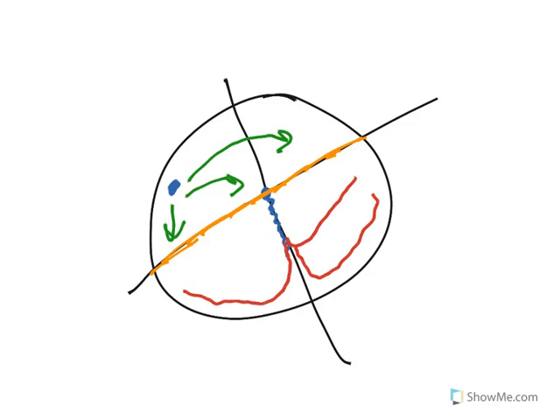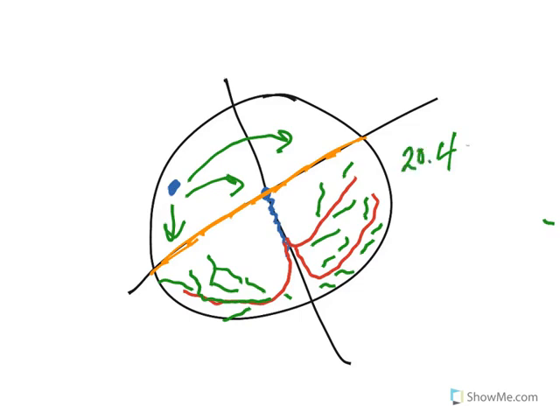Most people will tell you, again, the vast majority of your QRS complexes, sure, they will be wide, because they generally come from the Purkinje fibers themselves out here, and then they fire up and fire out and away. Well, that takes longer. Remember when we talked about bundle branch blocks, if you're going the back roads, firing out of all of these Purkinje fibers and not actually firing out of those bundle branches, then you're going to see wide complexes, because conduction is going to be delayed, and it's also going to be at a ventricular rate. So it's usually in that 20 to 40 range, and that's normal.